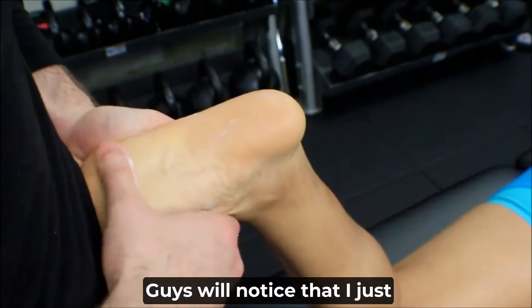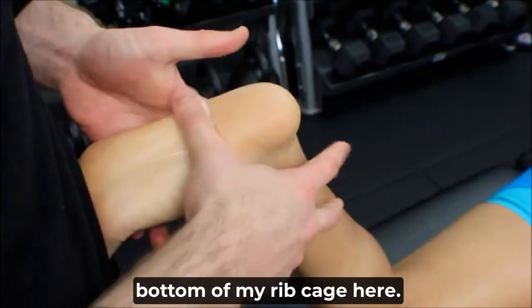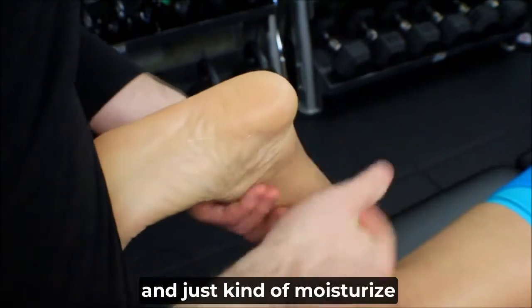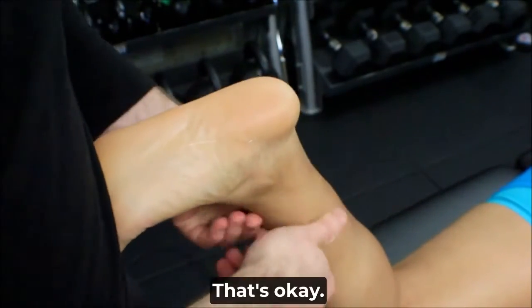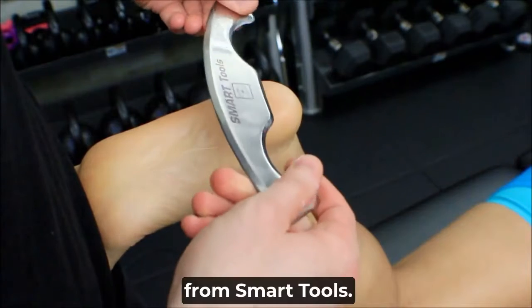You guys will notice that I just have her foot stabilized against my stomach and the bottom of my rib cage here. Again, I used just a little too much cream, so we'll go ahead and moisturize Sonia's ankles here. That's okay. Then we're going to go ahead and use this batarang tool from Smart Tools.